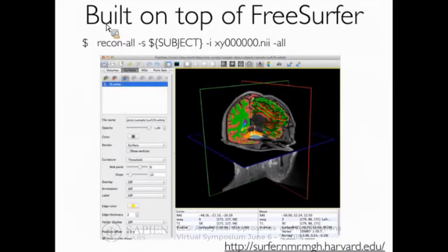MNE is built on top of FreeSurfer, which means that MNE Python doesn't have any code that allows you to process MRIs or anatomical information. All this is handled by FreeSurfer, and you don't have to be an expert in FreeSurfer to use this. Basically the command you see at the top is recon-all dash the name of your subject, and then dash i you would provide the nifty file or dicom file and let FreeSurfer run. You will get the processed MRI like you see on this image, which is what MNE relies on to do all the source imaging.